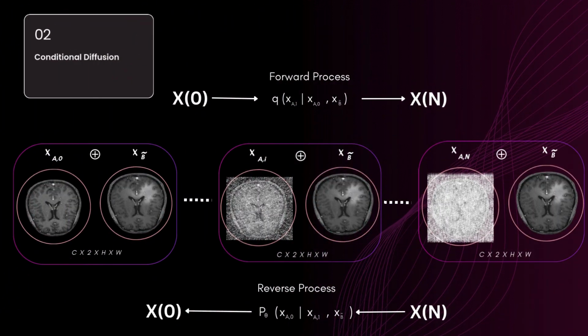Moving on, the next phase of our approach is the diffusion model. The diffusion model is designed to reconstruct healthy versions of tumor-infected brain images for anomaly detection and segmentation. The backbone of our model is an improved UNet architecture. Our model uses a time-dependent noise schedule to add and remove noise during the forward and reverse diffusion process. As seen here, during the forward process, noisy versions of tumor images are generated by combining Gaussian noise with the original image.